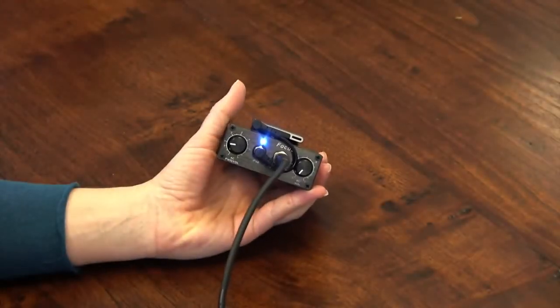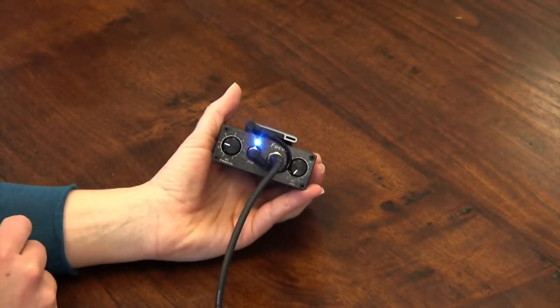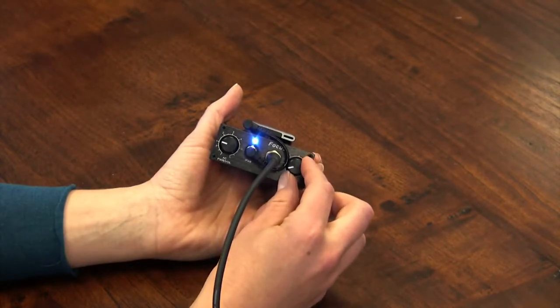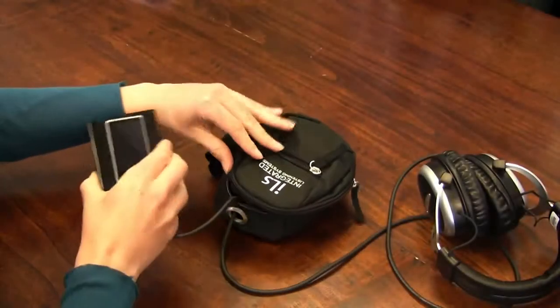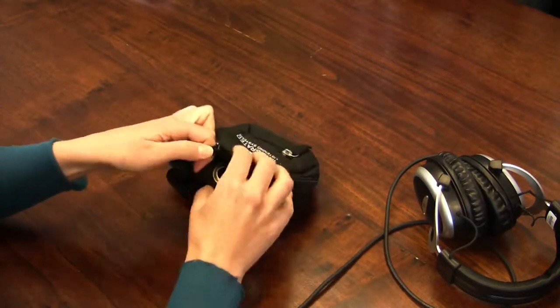Your air conduction volume should be set to a level that is comfortable and allows the listener to still hear someone speaking. Your volume level will vary according to your hearing sensitivity, so when beginning a session, start with the AC volume at 0.5 and adjust it from there. Set the bone conduction level as outlined by your supervising practitioner. You are now ready to begin your session. Insert the iPod and amplifier into the waist pack and zip it up.